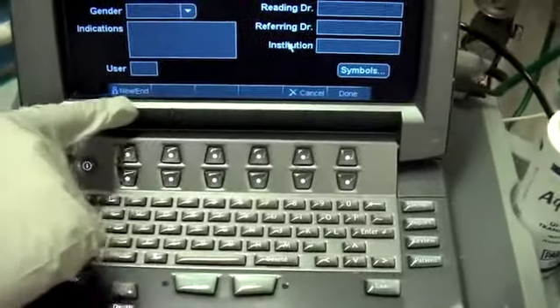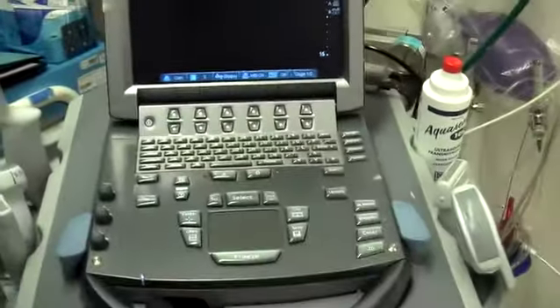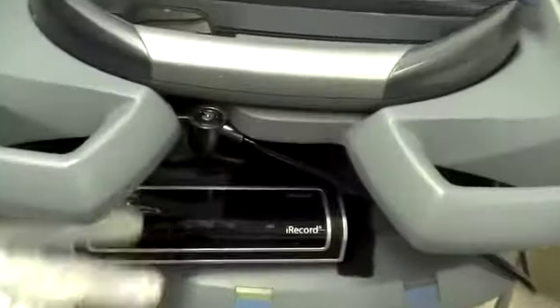All right. Once you have the machine on, you have to plug it in in order to turn on the digital recorder, or the iRecord down here. So as soon as I find the plug, I'll plug it in. Oh, it's plugged in. It looks like your colleague already plugged it in here.